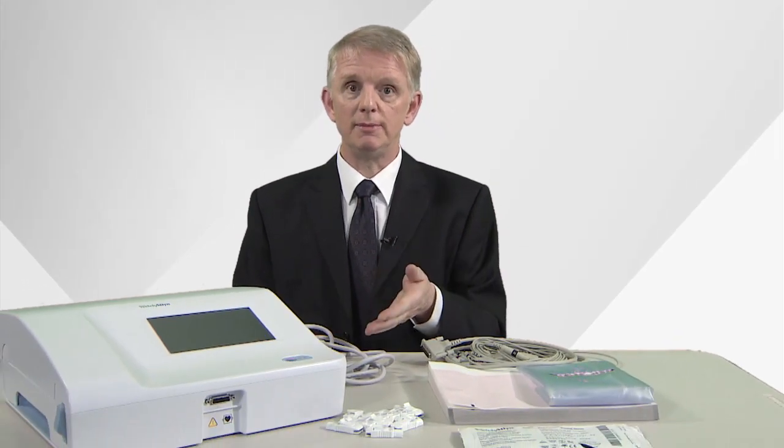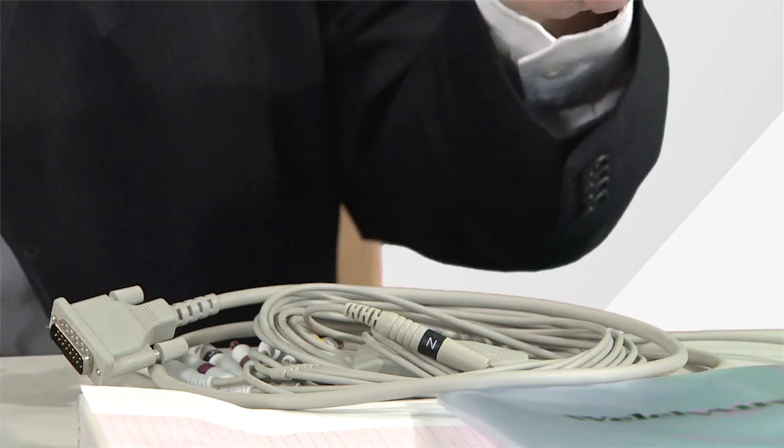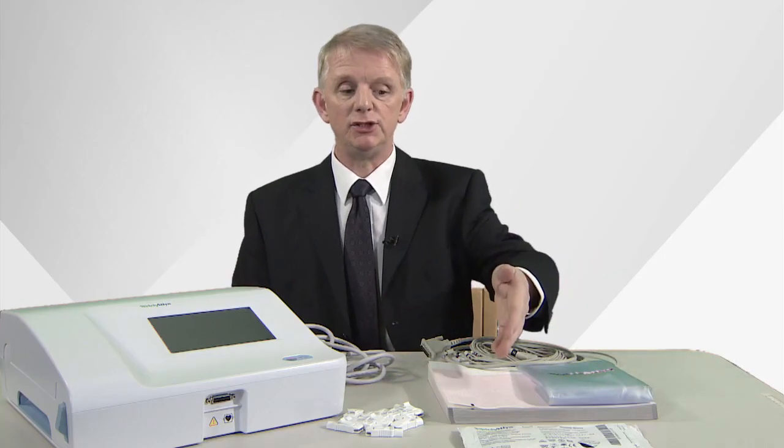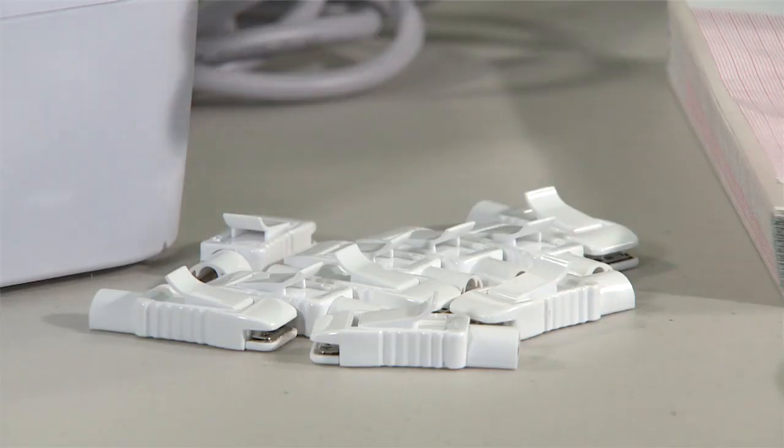First of all let's look at the components. The ECG comes with a mains cable, a patient cable, a dust cover, ECG paper, ECG electrodes and ten crocodile clips — one for each end of your patient cable.